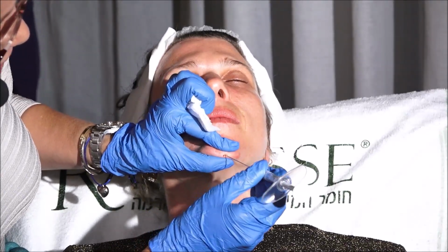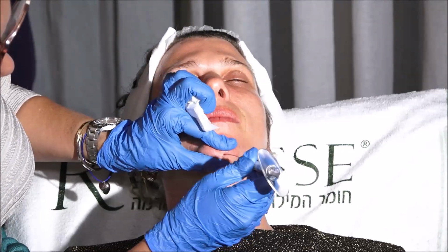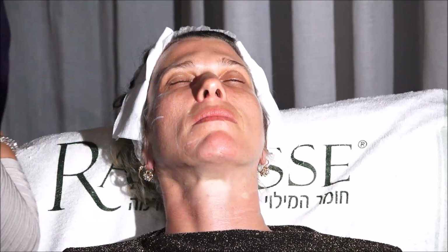So normally, I don't want to inject in the muscle. So I try to get as close to the muscle as possible. So I'm going to be super fascia here also. And can you give me the needle again?